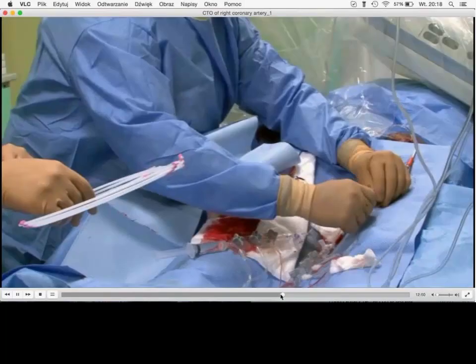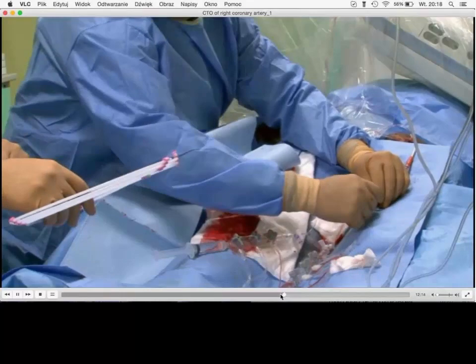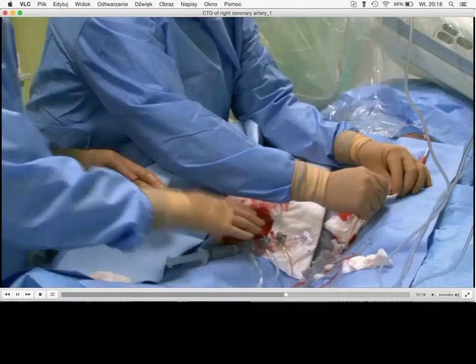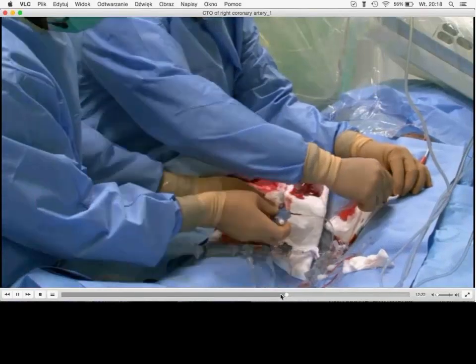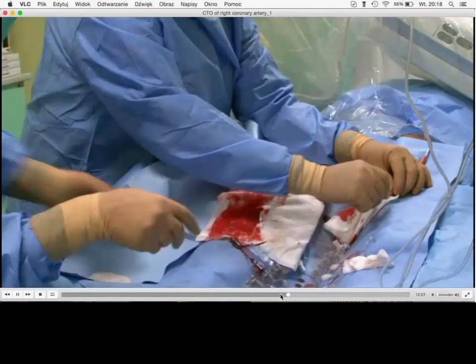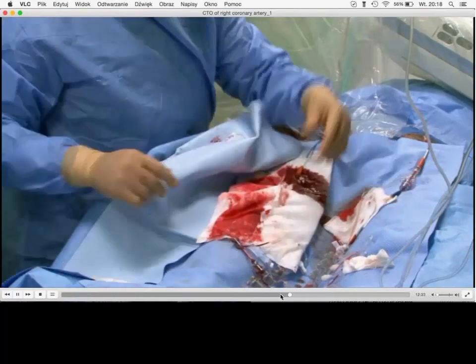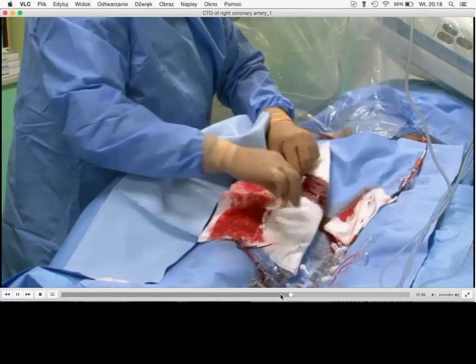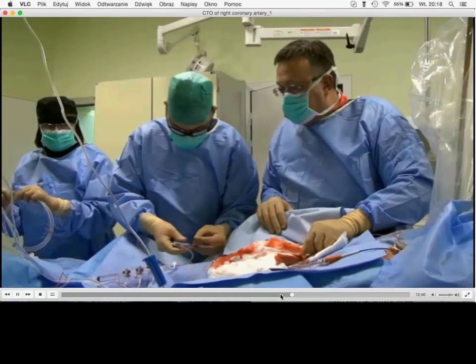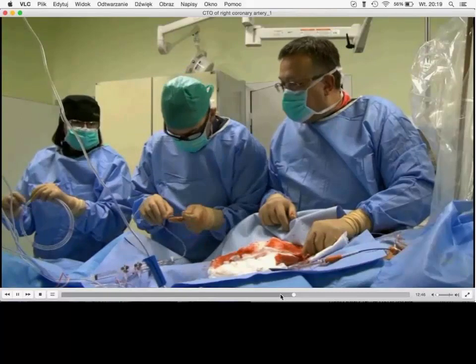Does this qualify for contemporary reverse CART? I guess it was a small enough balloon? It's 2.5. It's not too small, I think. If it failed, we used the bigger balloon. There are some people who start with 3.0 or 3.5 in the proximal RCA. But I'm still thinking that if we are not sure that we are within the lumen, sometimes we are in the subintimal space, always, in the majority of cases. So I think it's reasonable to start with 2.5.